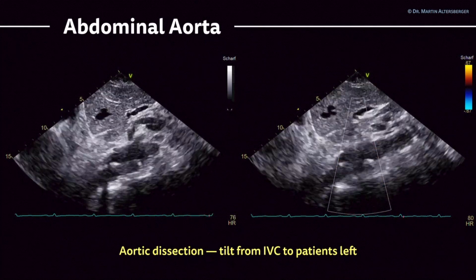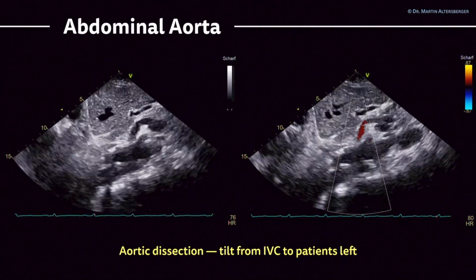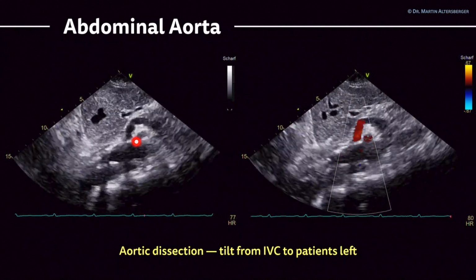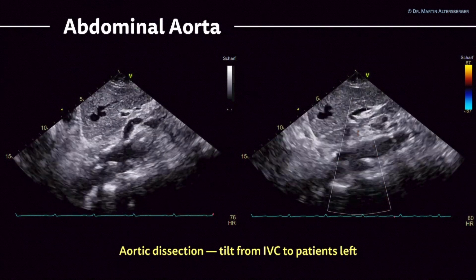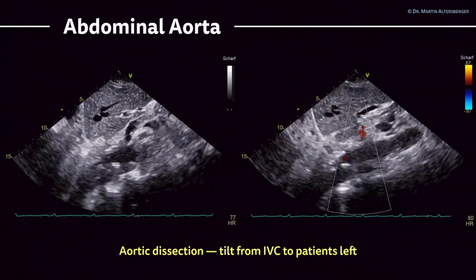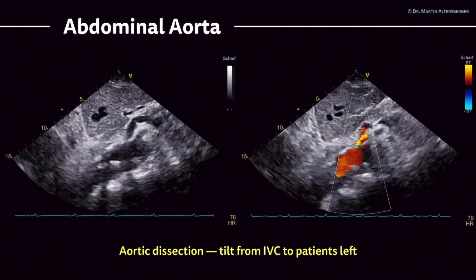In this case, you have a severe pathology. You see that there is a membrane. So you have two echo-free spaces. You have here the mesenteric artery, here the superior mesenteric artery, the celiac trunk. And when you utilize color Doppler, you do see you have here two overall possibly blood-filled structures.